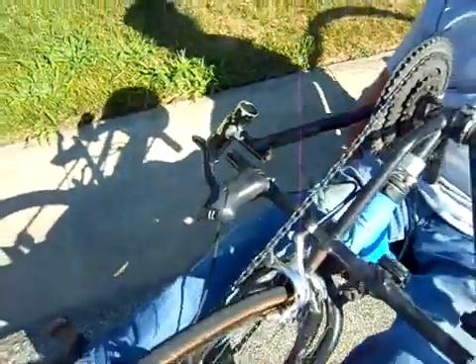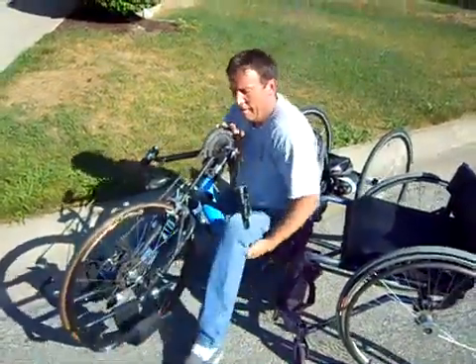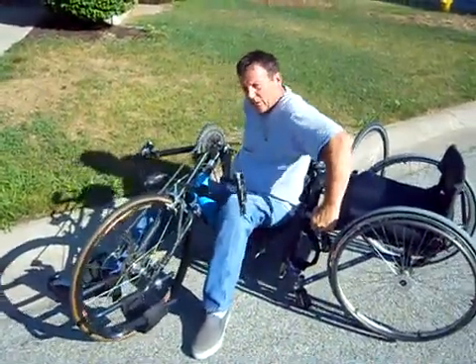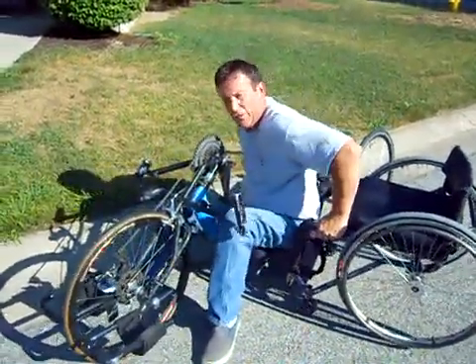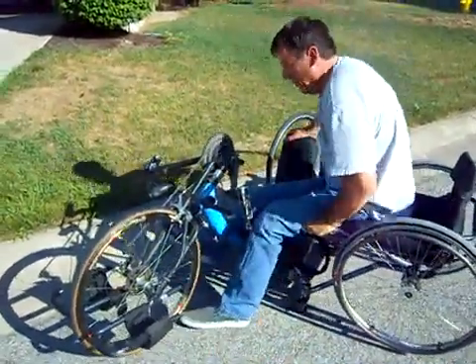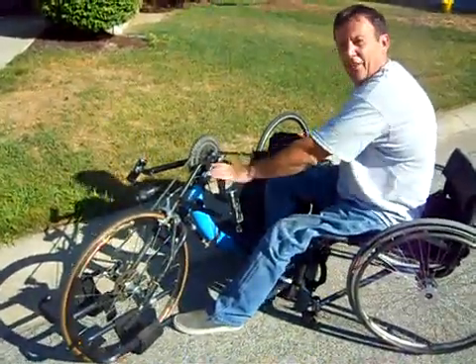To get out, just do that in reverse — put your feet on the ground. If you want, certainly have somebody hold the chair or the bike while you do this. Just transfer right up to the seat, and then pull your feet back over, and you're done.